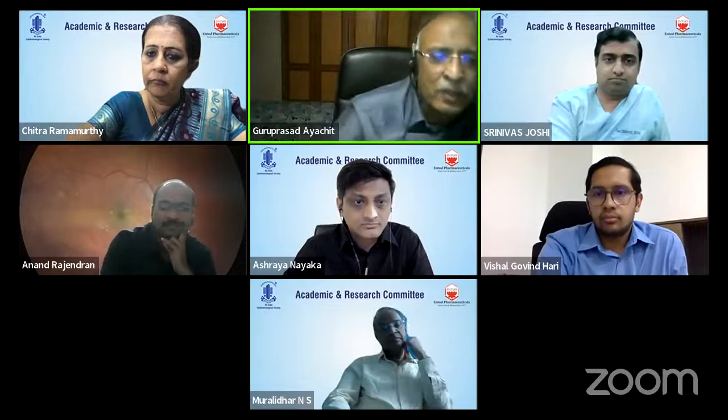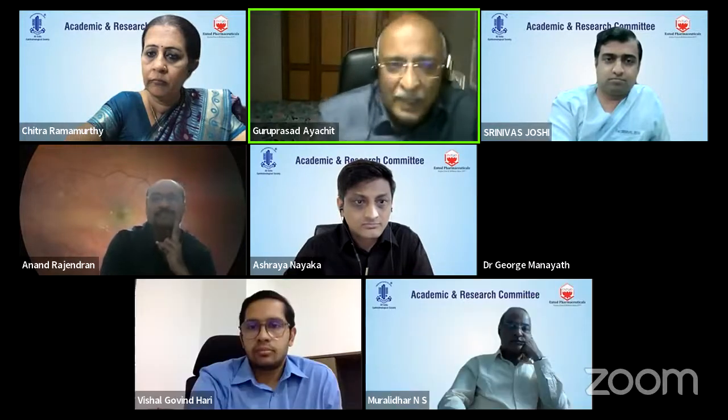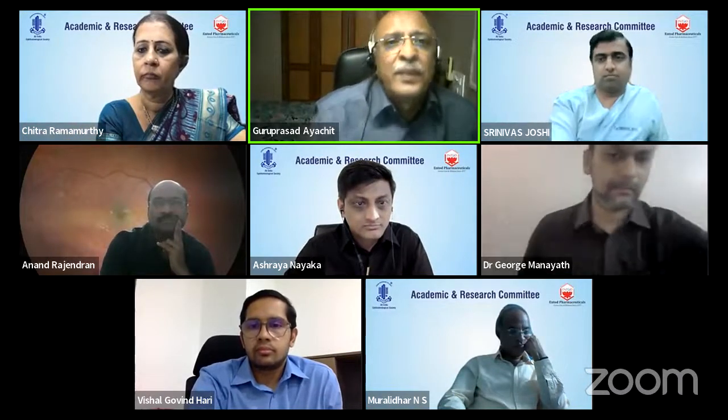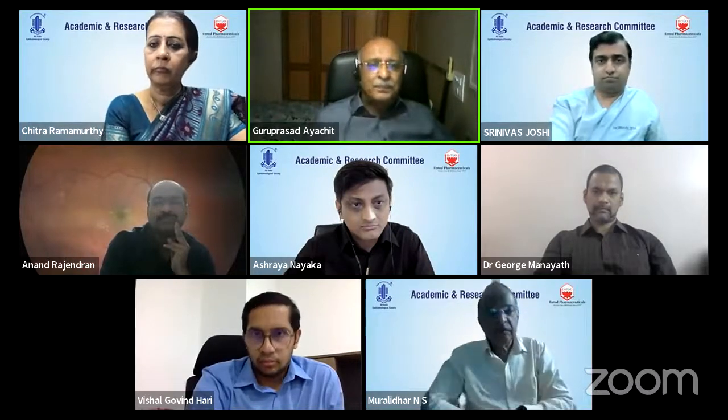We don't have access to more than 102 degrees of angiography, not more than what the Heidelberg can give us. But if wide angle angiography means more than 102, then I think tightening the PRP is good enough to cover up the untreated areas, and that doesn't really result in treatment or cure of a recalcitrant DME. I just want to know the opinion of the panel.